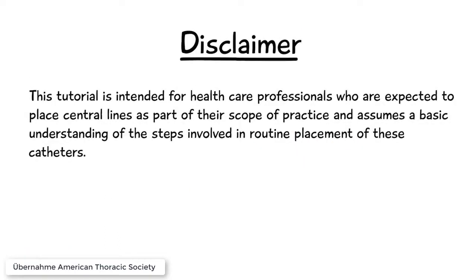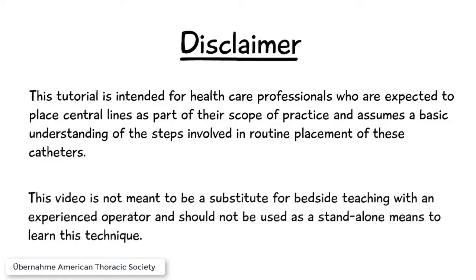This tutorial is intended for healthcare professionals who are expected to place central lines as part of their scope of practice, and assumes a basic understanding of the steps involved in routine placement of these catheters. This video is not meant to be a substitute for bedside teaching with an experienced operator, and should not be used as a standalone means to learn this technique.